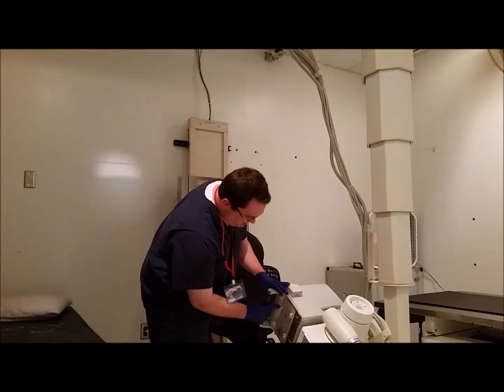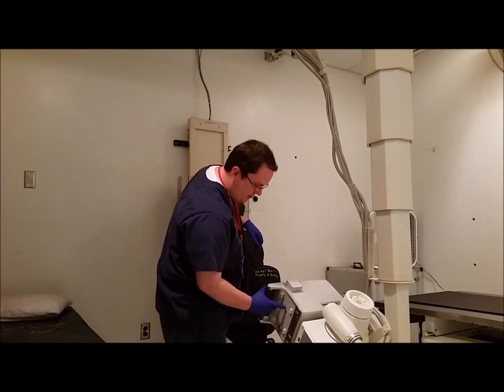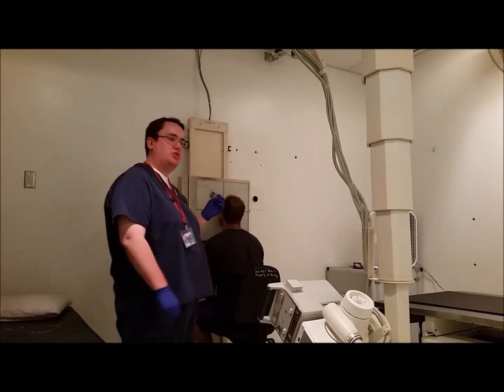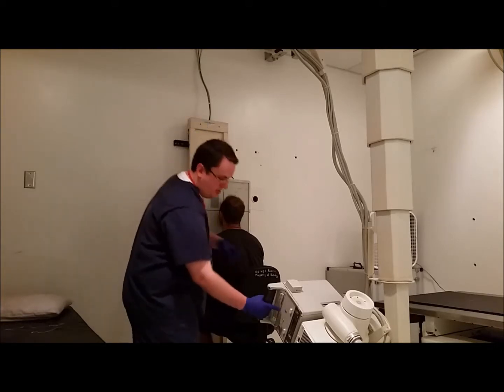All right. Our marker in place. Got that IR in there. All right, we'll be shooting about the same thing, 75 at 12. All right, hold your breath, sir. Click. All right.